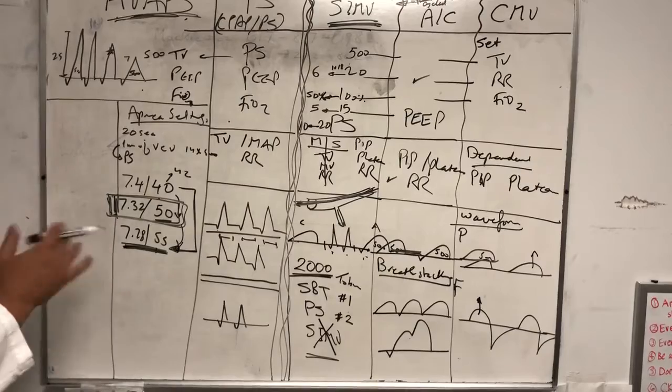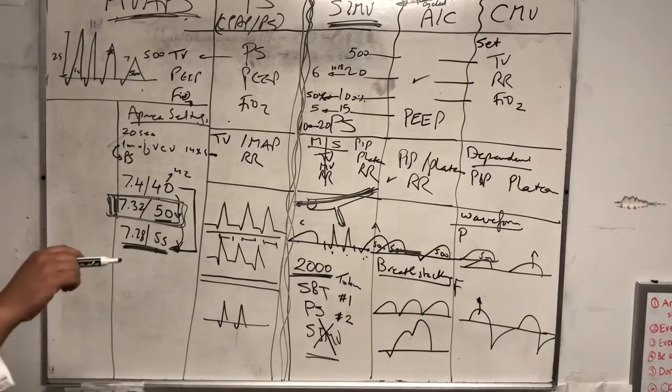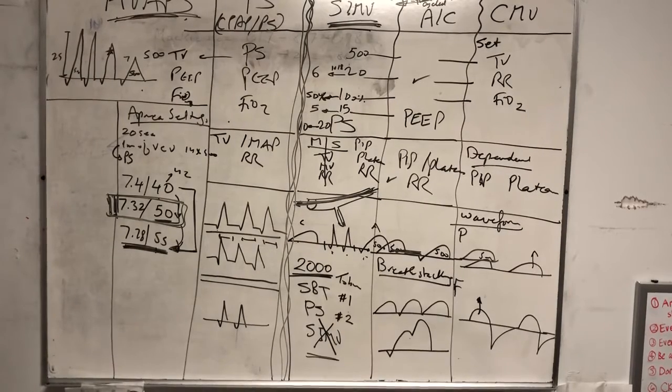What you do, you go with them in the room and you keep resetting the alarm. The alarm happens every 20 seconds. It happens before they give the breath. The machine gives the breath. So reset 10 times or something, and then the patient will breathe. Okay? Yeah, it's fine. 10 times, it's still oxygenating. They're getting oxygen, so they're going to build up CO2 until they breathe.